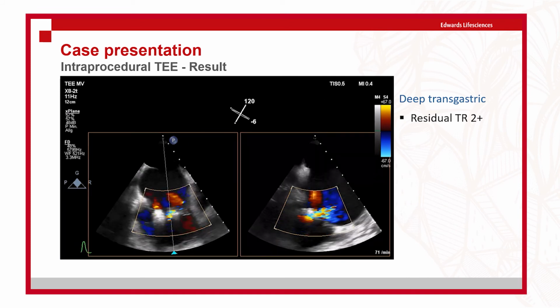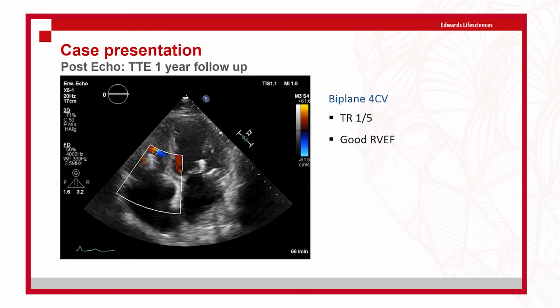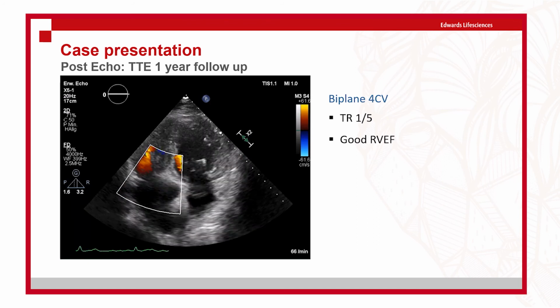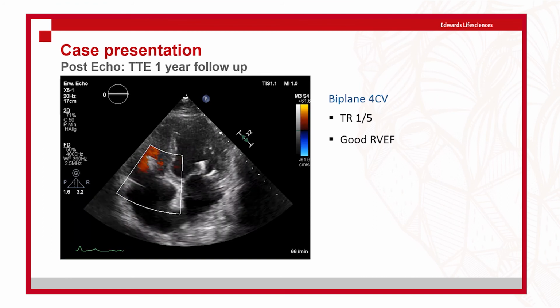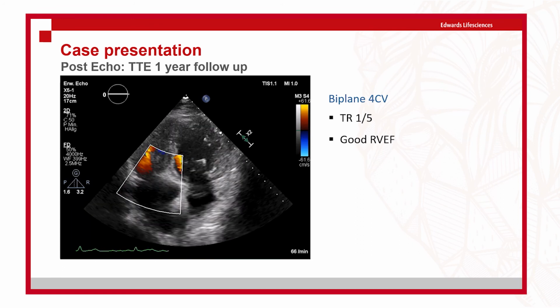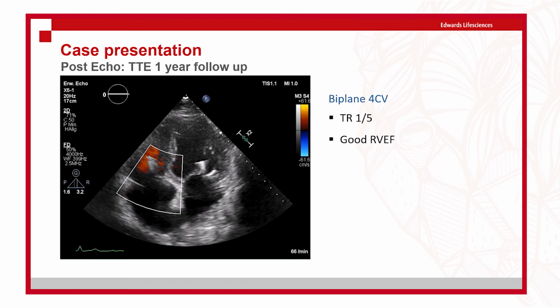But what is interesting is that we can provide the 1 year follow-up in this patient, as this was a compassionate use last year. The patient just came back this week to get his 1 year follow-up result. And you can nicely see that this is a TR 0 to 1 after 1 year. You see a remodeling of the formerly gigantic right atrium. The BNP values totally normalized, and you see still a very good function on the left-hand side and right-hand side. And we have no regurgitations on the AV valves, with a mitral clip on the mitral side, and the first double PASCAL on the tricuspid with a 1 year result.